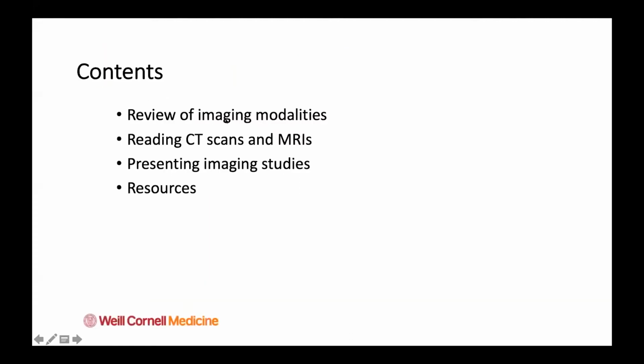Initially, I'm going to review some imaging modalities, the different types of scans we do, and I'll mainly focus on reading CT scans and MRIs because of our time limitation. I think that's going to be the most high yield. Then we may look at a couple imaging studies and put that together, and I'll share some resources to help you along.